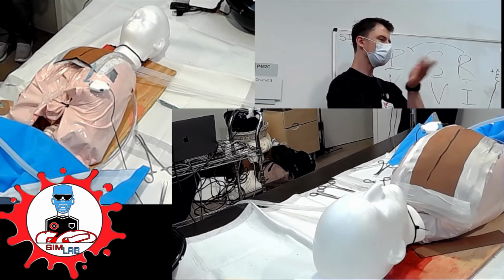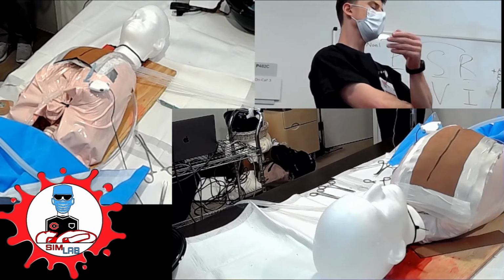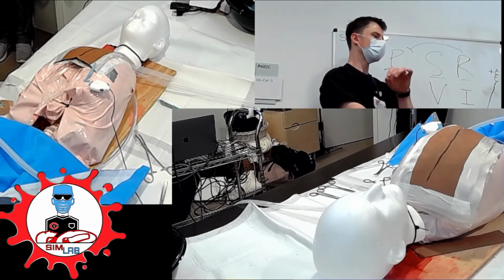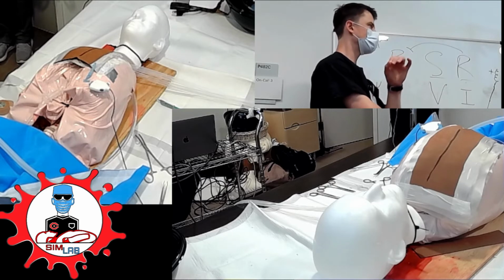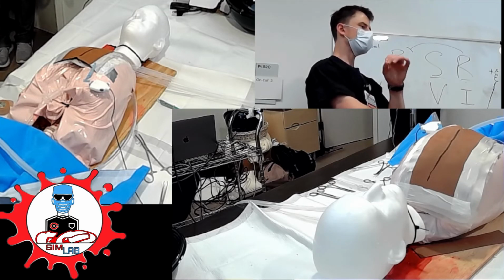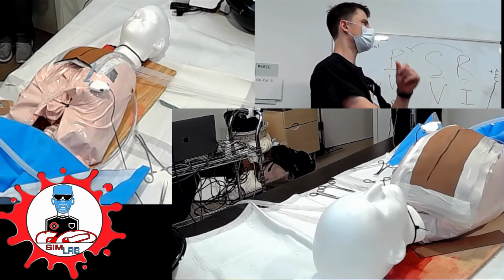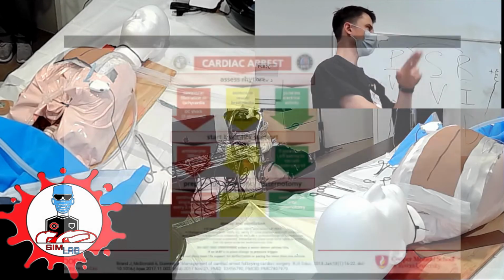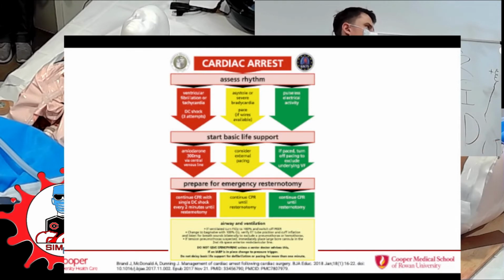Yeah. So what you were pointing out is that the guidelines for cardiac arrest in cardiac surgery patients are slightly different. If someone goes into VFib, the first move is to shock up to 3 times within 1 minute before starting CPR. And the other thing we pointed out is if they're in asystole, pace them, or try to get them paced within that 1 minute period before starting CPR.